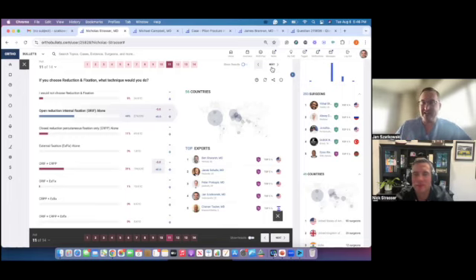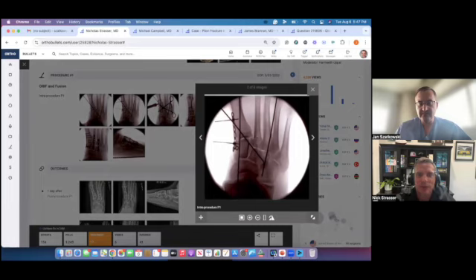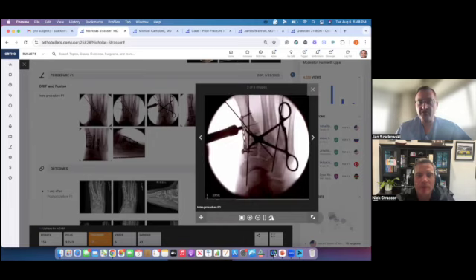Yeah, all right. The intraoperative images from this aren't amazing. I wish I could have had better images, but you can kind of see what we were attempting to do here. You see the joint's been prepped, kind of. So can you tell me your sequence here?